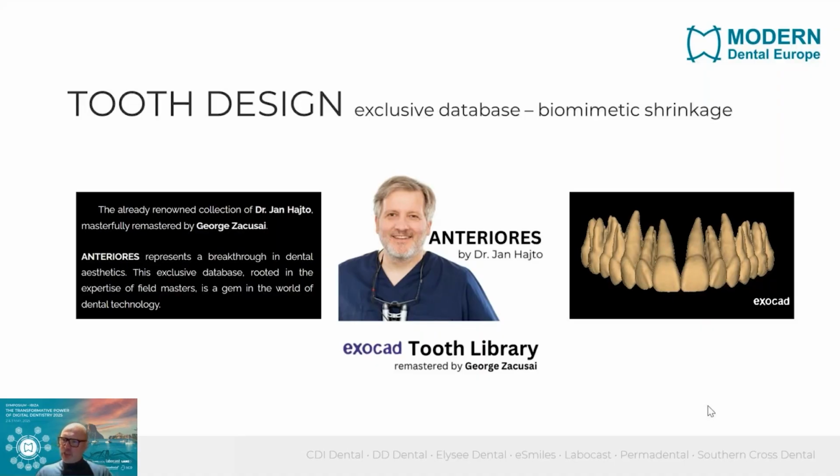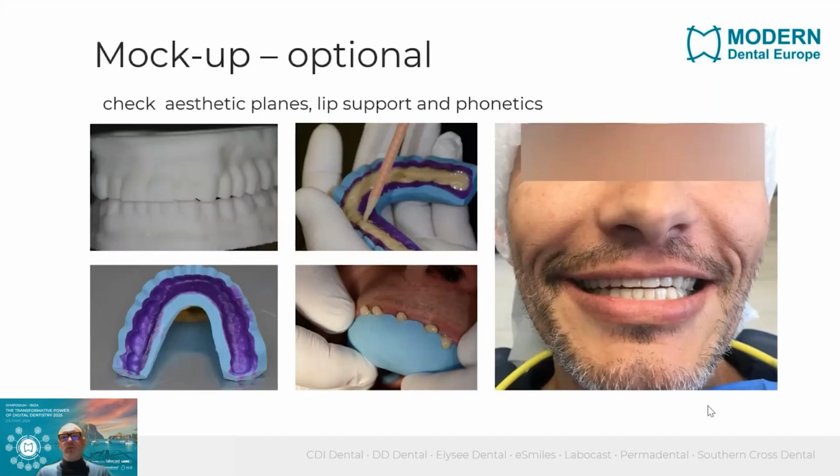And this is a feature we are actually using in our FIT for veneer solution, because there we are injecting in 2 steps. First, the dentin layer with the dentin injectable composite in a translucent key, and then we move on with an enamel composite in a translucent key.